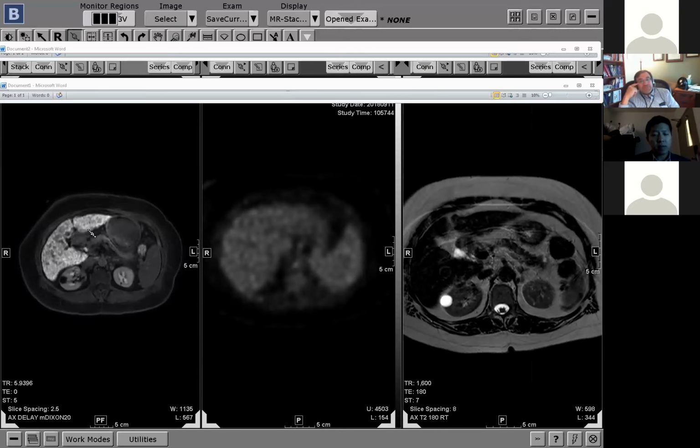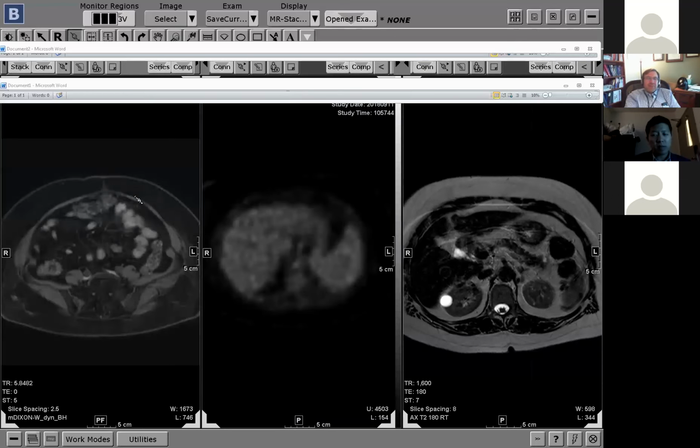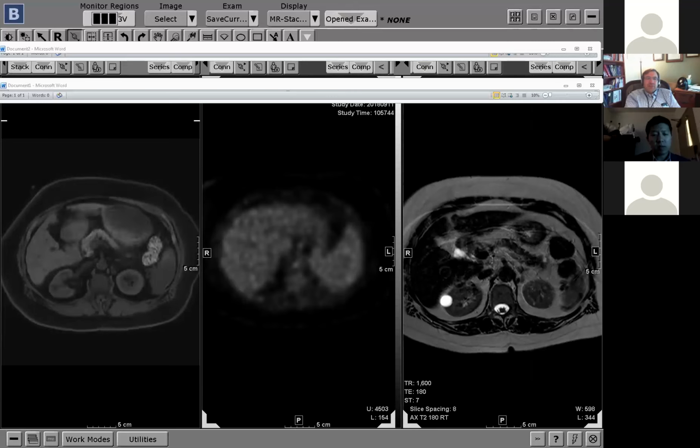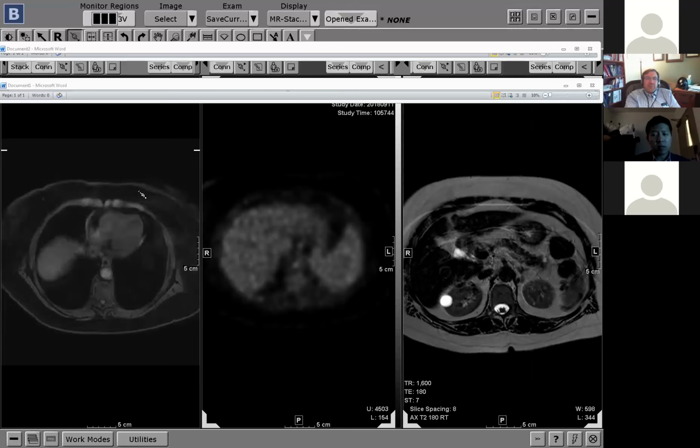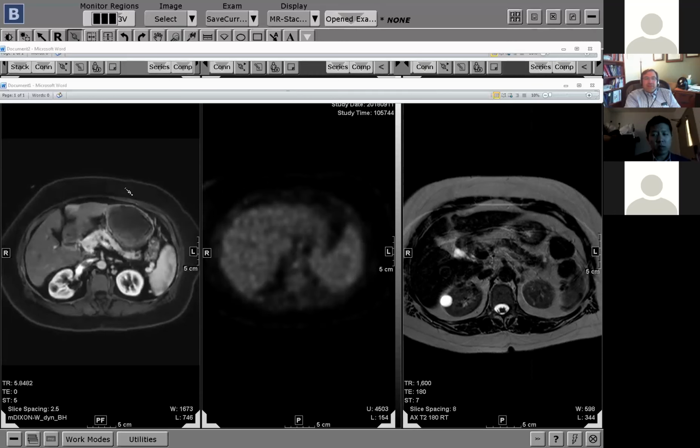So what do you guys think? Callable? Not callable? I have a pretty low threshold for sending someone for EUS if I see something funny, but it's impossible to say. I might have said something about the fact that there's something that looks like an IPMN next to a duct that looks a little bit more dilated, and I might say, is it a mixed type IPMN that's worth investigating? But I might not have called adenocarcinoma of the pancreas.